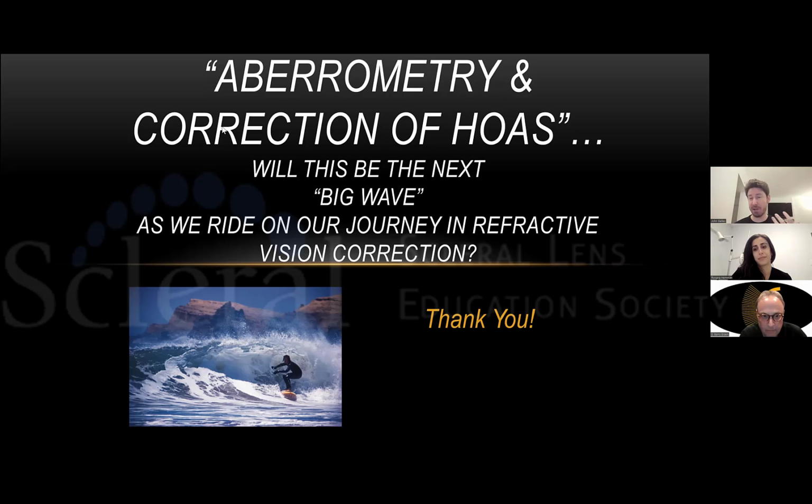If you look at lenses, they put lenses on eyes that were created directly to the line of sight, and then some that were geometrically centered. And what you saw was this massive disruption of vision, change in the aberration. So if you're doing that in a spectacle and you're not looking perfectly into the optical center of those, right into the line of sight, they're going to end up with way worse vision than what they would have had with the positive outcome on that.